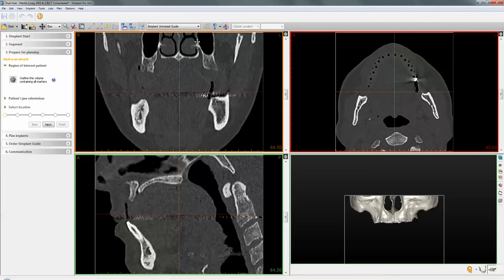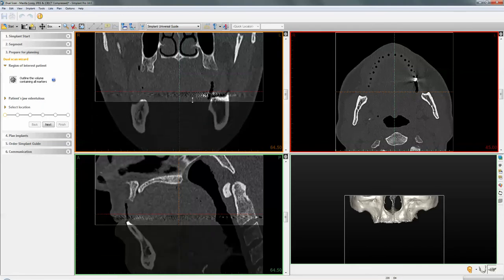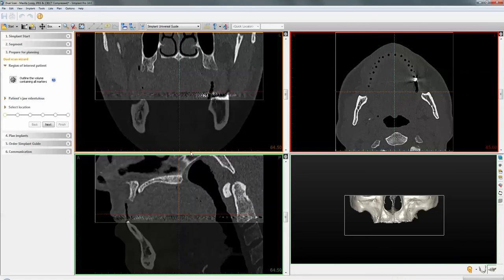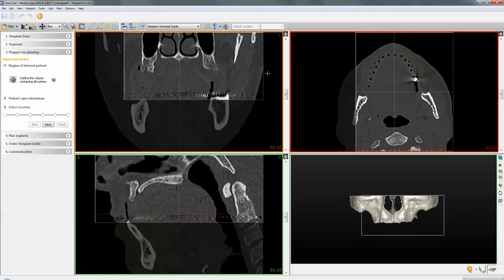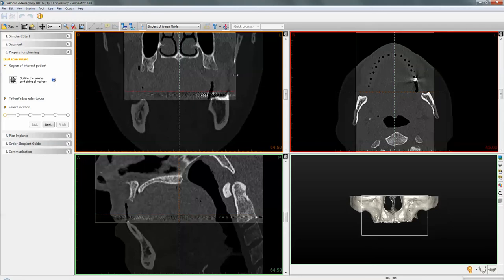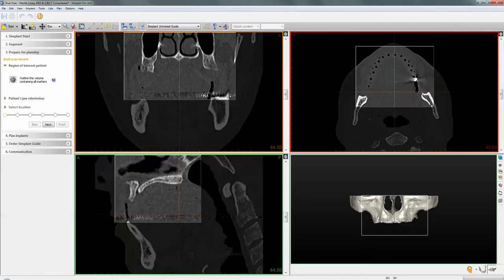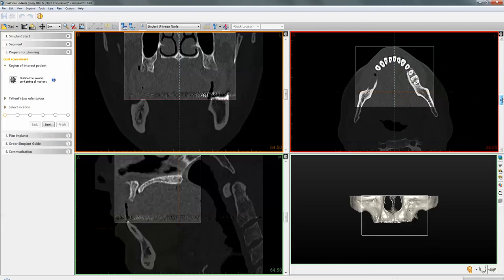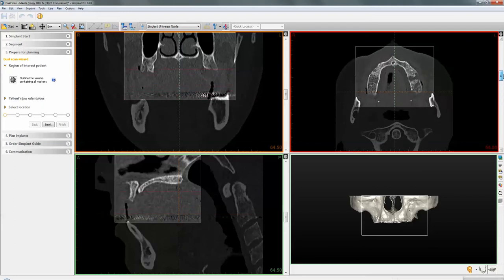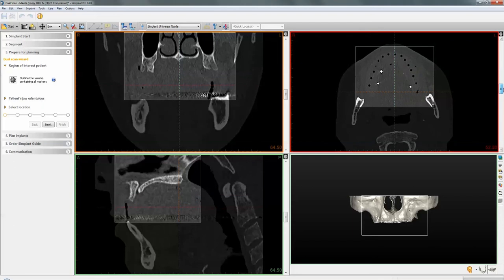This is now a search field. If you were to leave it as is, it will take a long time for your PC to find the beads and calculate them. So reduce the search field by dragging the white block and the lines on the left towards the right to narrow the search area. The smaller the search field, the quicker the merge. Make sure the beads are all within that block, then click Next.